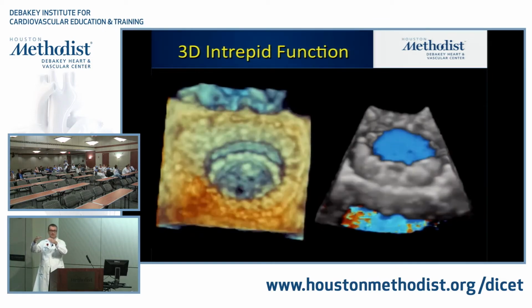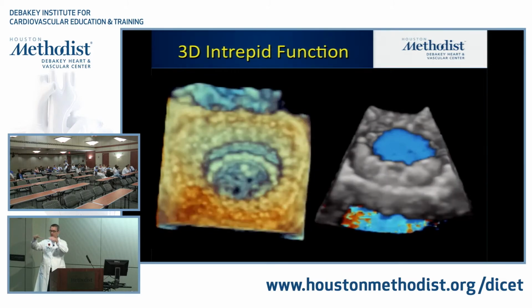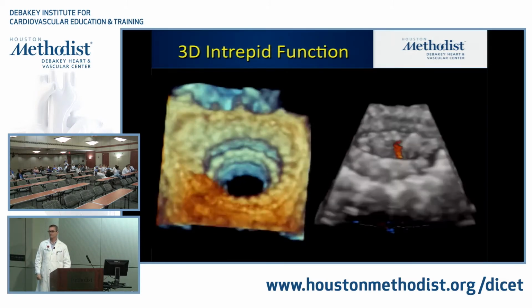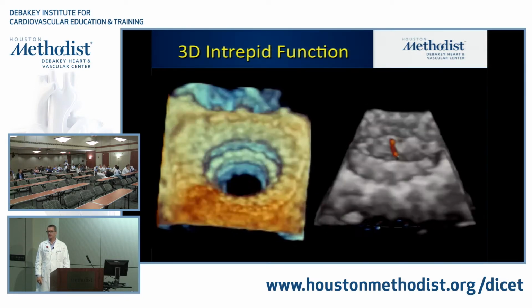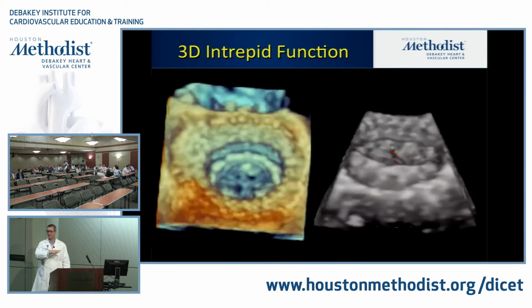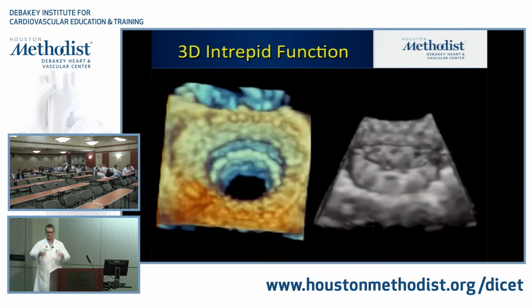The annulus doesn't stay dynamic this way, it stays dynamic this way. So you preserve the annular descent, but not the folding. But the circumferential change of the annulus gets lost. It's fixed. You fix it for this device. Some of the other devices actually have an annular folding that they try to maintain. This particular device, it fixes it.